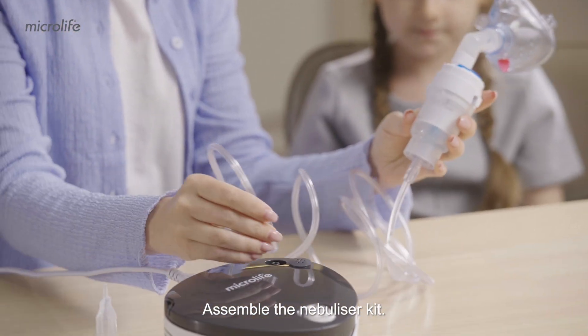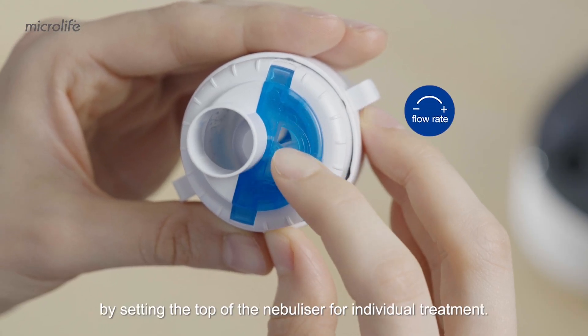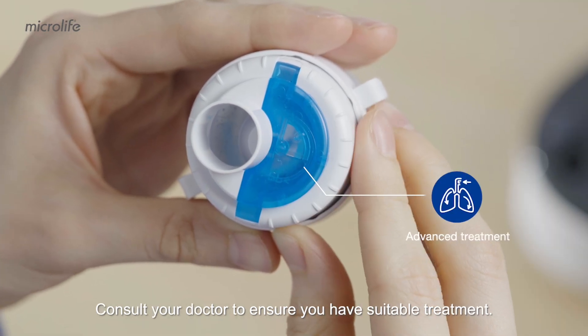Assemble the nebulizer kit. Connect the air tube and plug in the power lead. The flow rate can be adjusted by setting the top of the nebulizer for individual treatment. Consult your doctor to ensure you have suitable treatment.